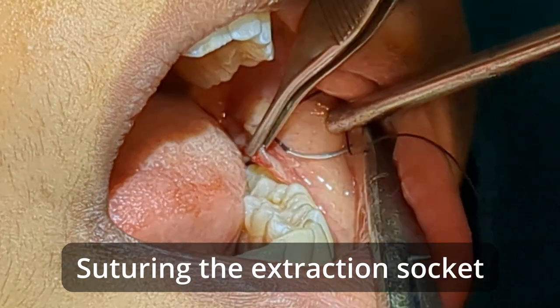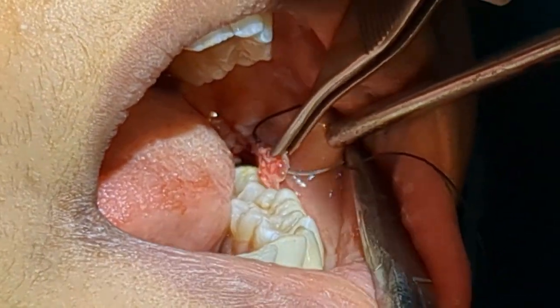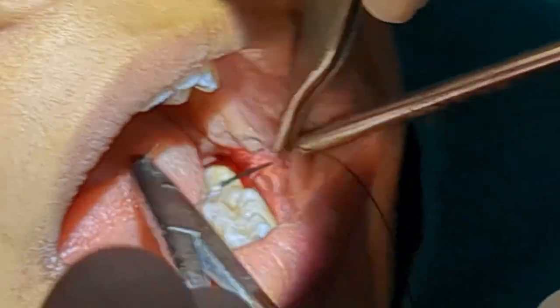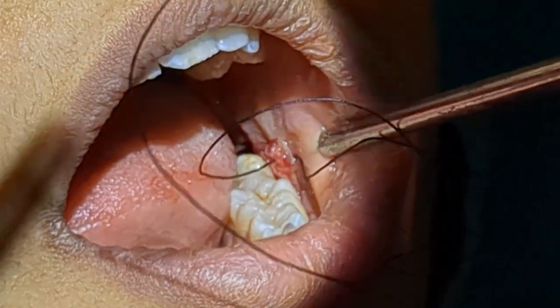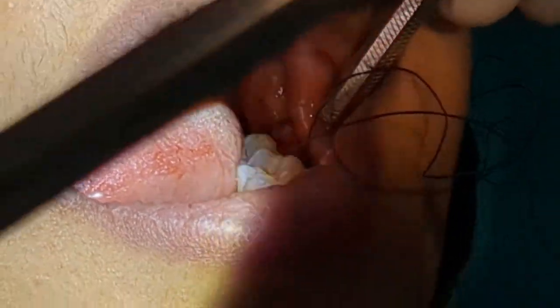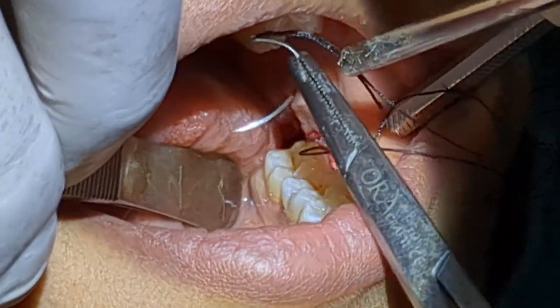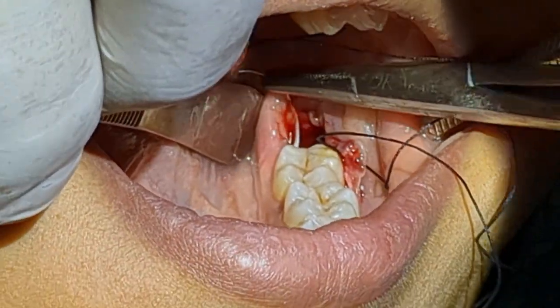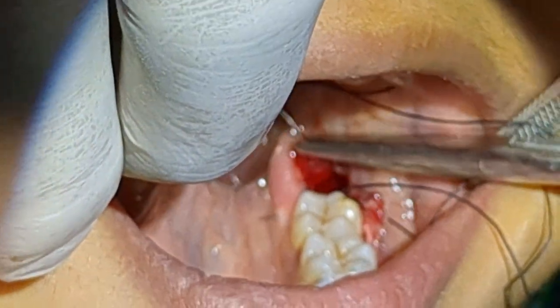The first suture is very important. I'm going to take a bite in the mesial papilla of the socket. We have taken the bite in the mesial papilla. Now this step is very important — while taking the lingual bite, the direction of the needle should be a little in the mesial direction.